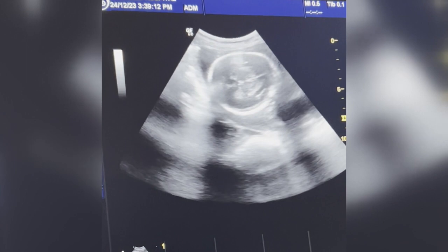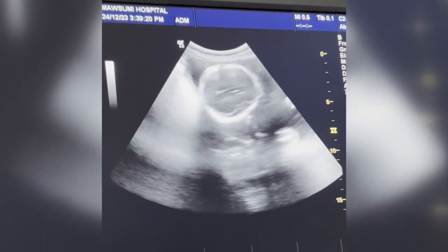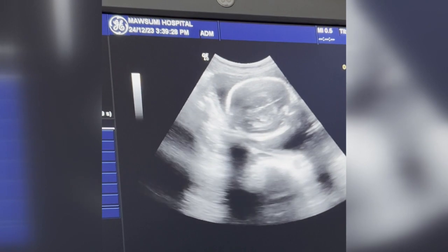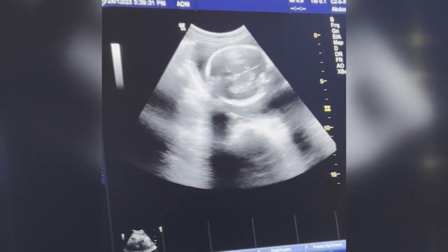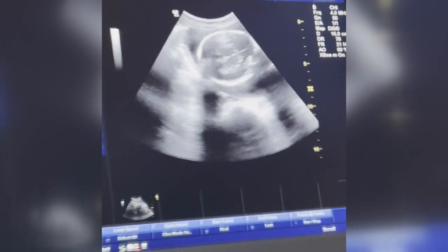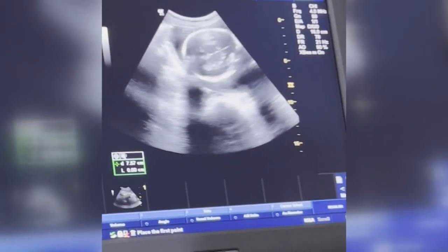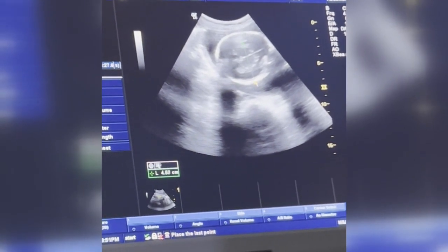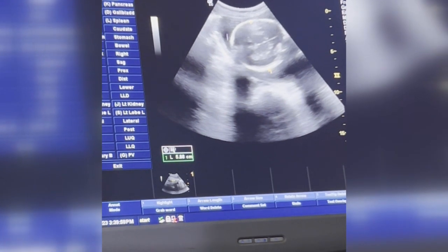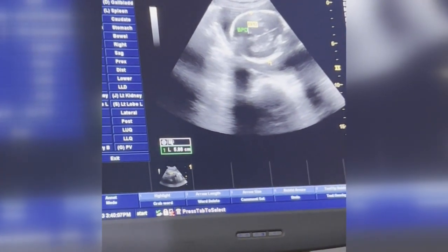Now, it is like a rugby ball, so it is biparietal diameter, head very nicely displayed. Now I am doing measurement of biparietal diameter, BPD. I have written it here.